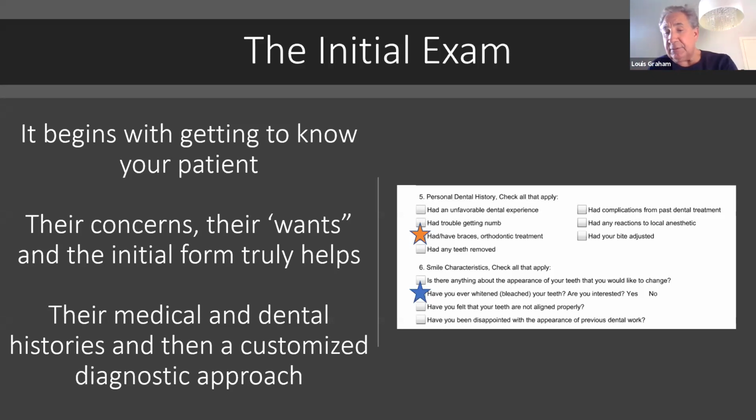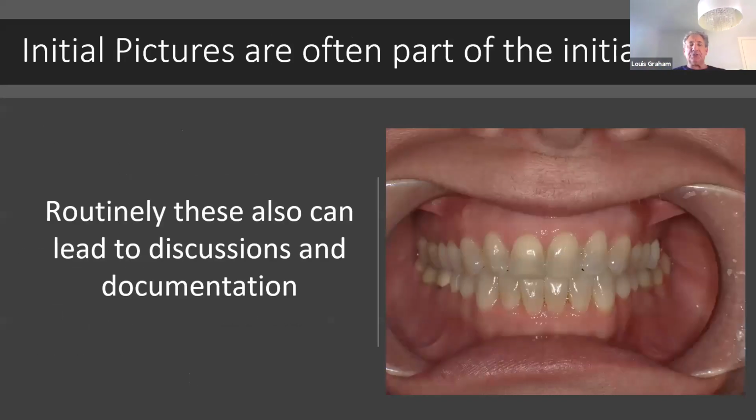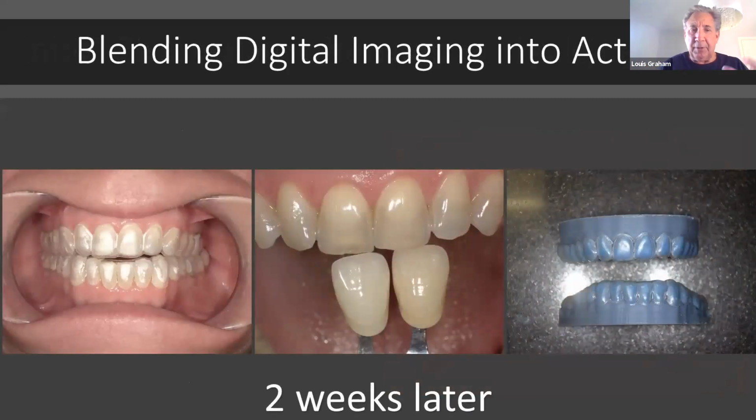And in this case, this patient wanted to have her teeth bleached. So these are just questions we ask. I want to know their wants. From that, we'll take pictures like you've all heard, but pictures lead to discussions, no doubt about it. But we also do digital imaging on every case, and I'll walk you through it, so we can do time lapse and check for recession.